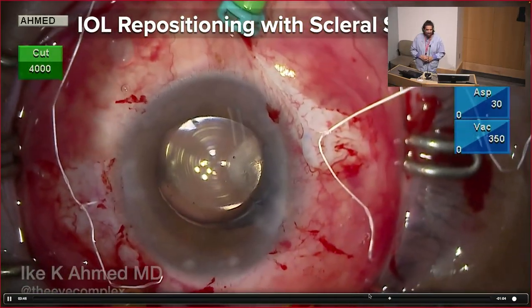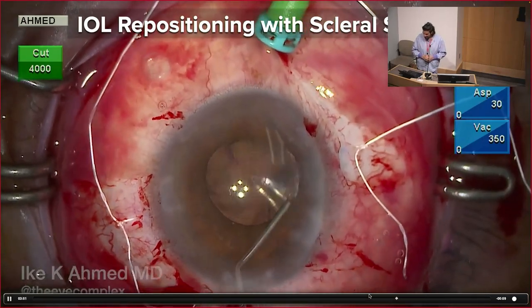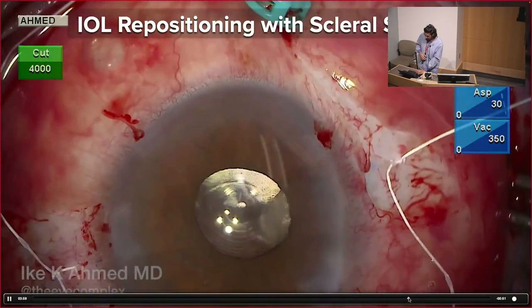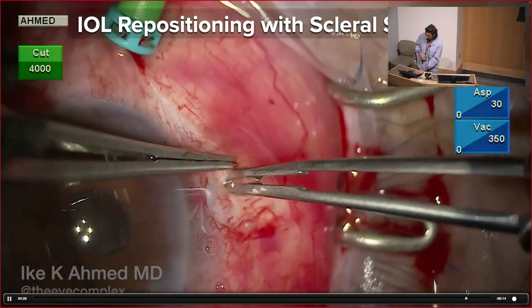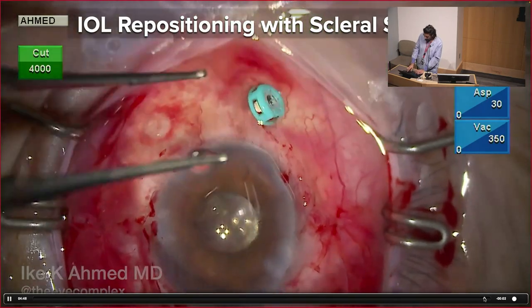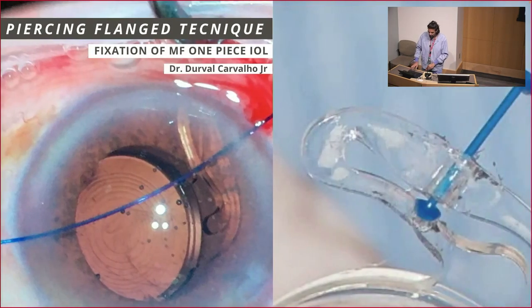And you can see the benefit of having an infusion line, which keeps the globe physiologically firm, and then ensuring we have good centration with that lens. And I think hopefully you can agree that we're pretty good there. We'll lock that, very important to bury those Gore-Tex sutures to prevent erosion, and verify that position is what we've done here. And you can see that the unoperated eye and the operated eye are fairly similar. Maybe you may tell me I created a couple degrees of tilt, but with that amount of exquisiteness as microsurgeons, it could be amazing.